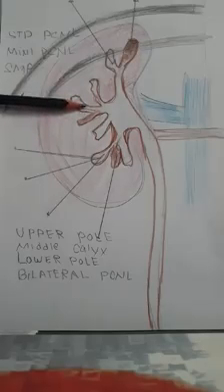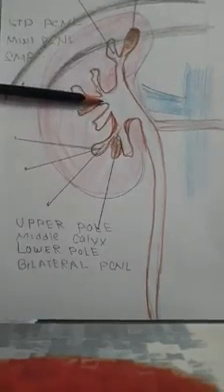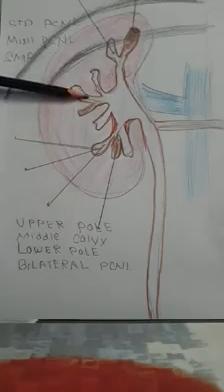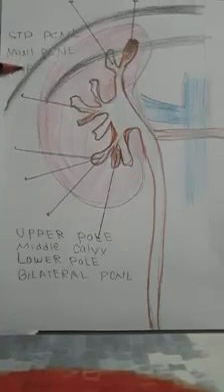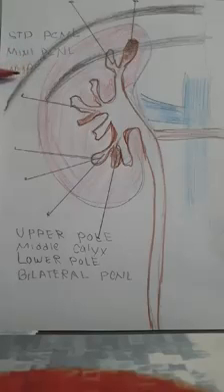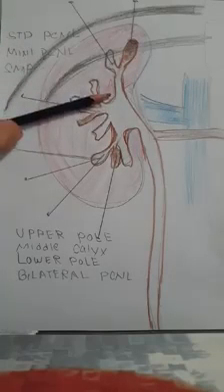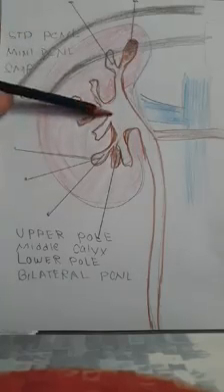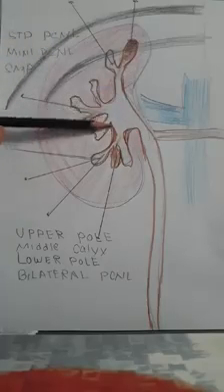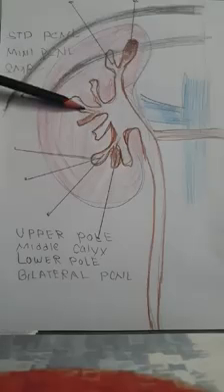It is easy to do, but with this technique I always use mini PCNL. Why mini PCNL? Because if you use a super mini PCNL, the problem with super mini is there is no access sheath, so you have only one scope. So if you want to maneuver the scope, it is difficult, and since the scope is very friable, you might break the scope. So when you are using super mini, you should be very straightforward to the stone and just fragment it, just leave it.